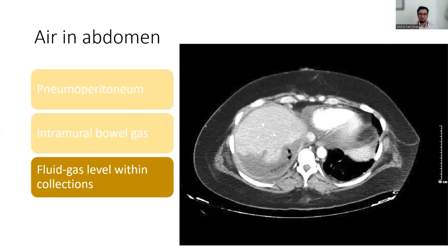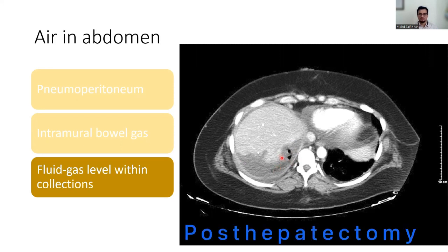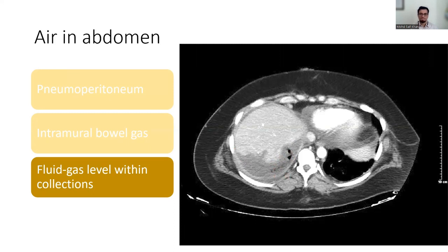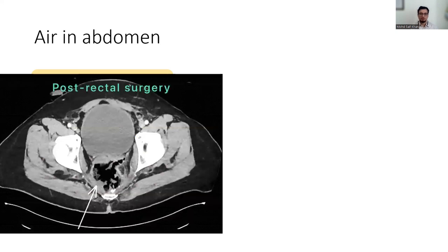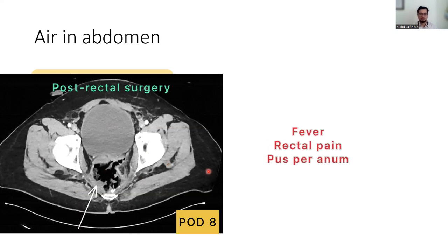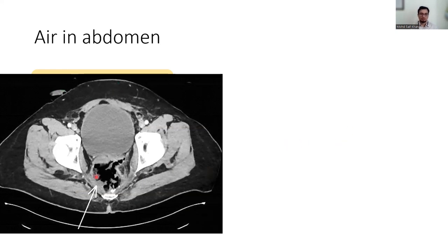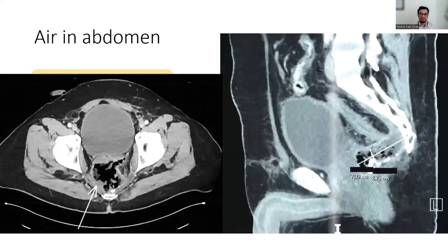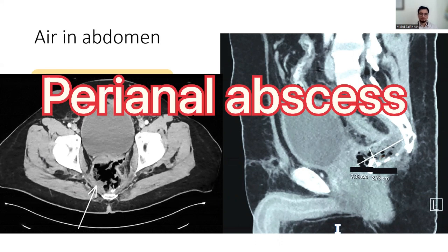In this CT scan there is a hypodensity in the lower part of the liver with air pockets — the patient had a history of hepatectomy and underwent percutaneous drainage whose culture was negative. Another CT scan done on post-operative day 8, in a patient with fever, rectal pain, and purulent anal discharge following rectal surgery, shows a lot of air and collection in the perianal region — this is a large pelvic collection with air pockets, consistent with a perianal or pelvic abscess.